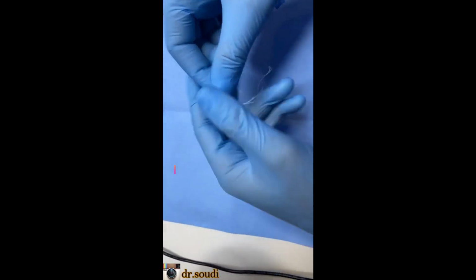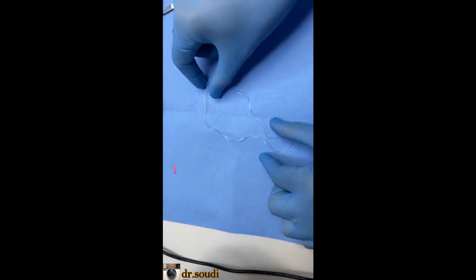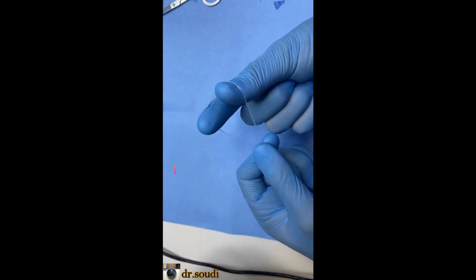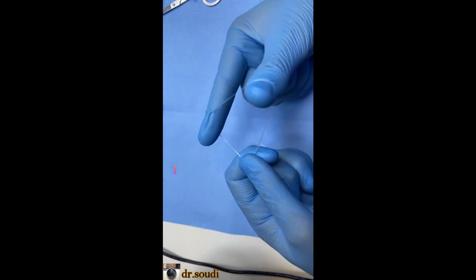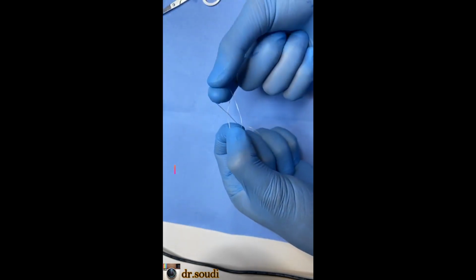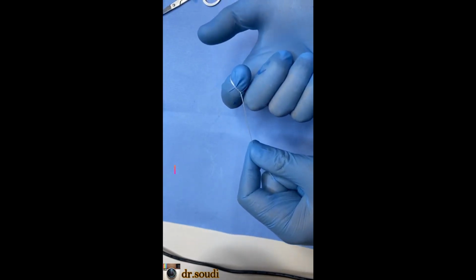Okay, this is clear now. I have a floss here, a large one. Don't take a small part like this and divide it into 2. Then place your 2 fingers like this, make it a triangle. This is a triangle floss. Then downward like this, and take this one. You know what I mean, right?